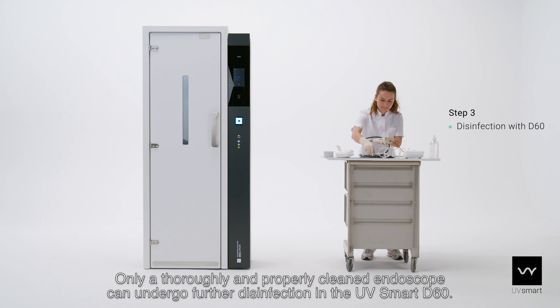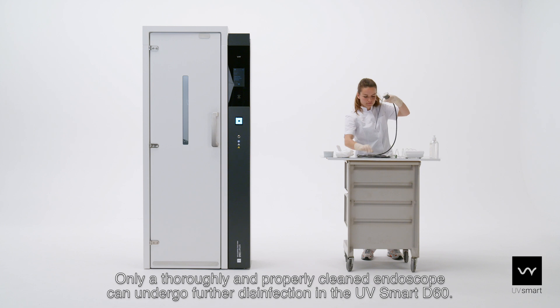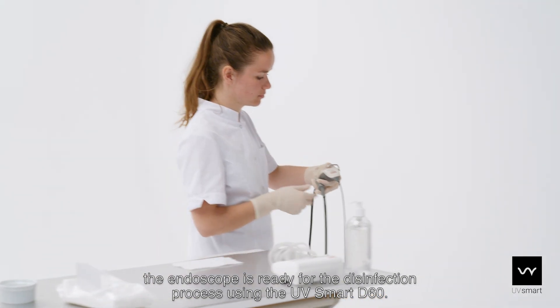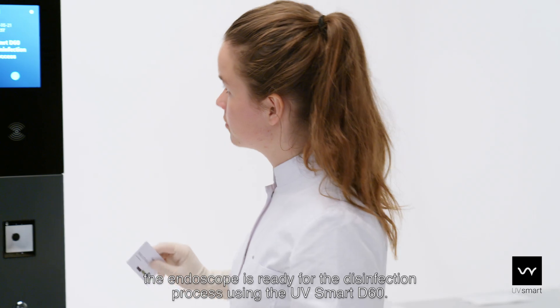Only a thoroughly and properly cleaned endoscope can undergo further disinfection in the UV Smart D60. When the cleaning process and leak test have been successfully completed, the endoscope is ready for the disinfection process using the UV Smart D60.